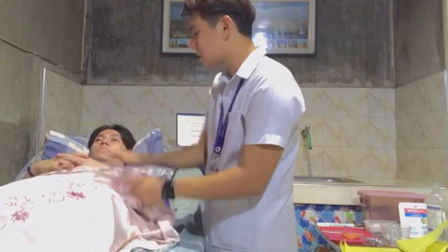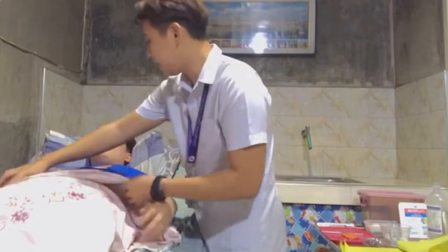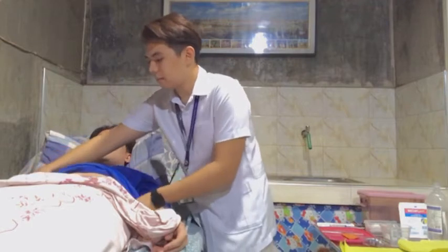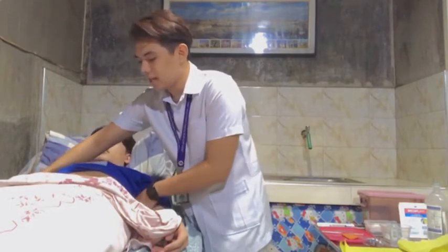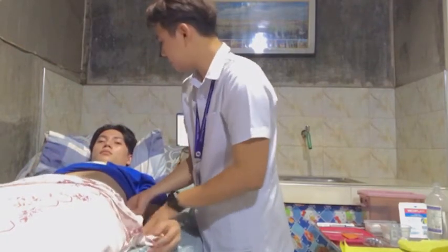Okay, sir, I'm exposing your abdomen, sir, okay? So, is your temperature okay? Now exposing your abdomen. And follow the rules in assessing the abdomen here. Are you comfortable?